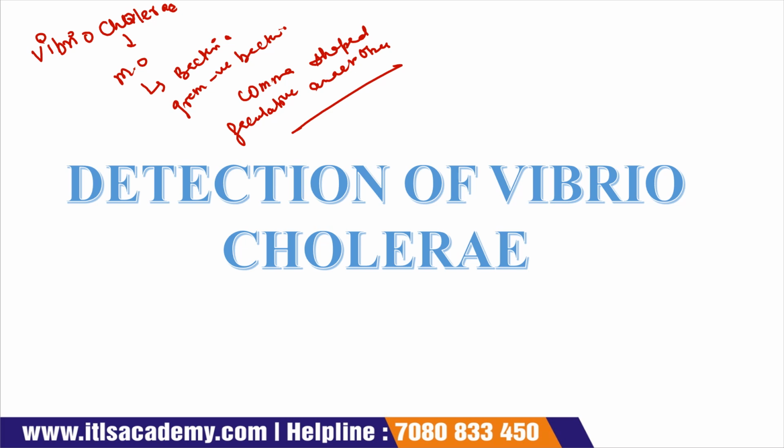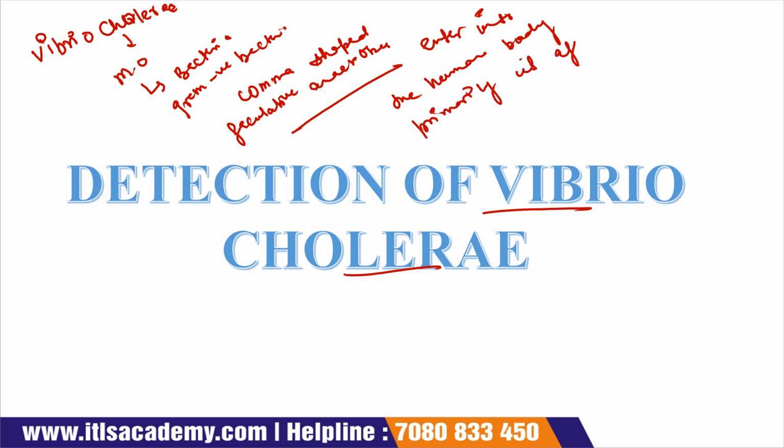Why is it important to detect Vibrio cholerae? If we are doing some experiment, then there is an aim for performing that experiment. The detection of Vibrio cholerae is very important, because when it enters the human body, it primarily affects the small intestine.